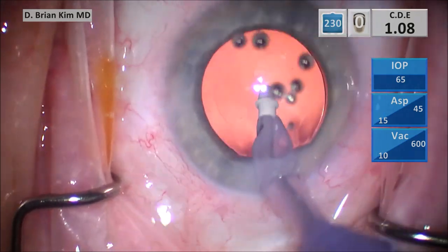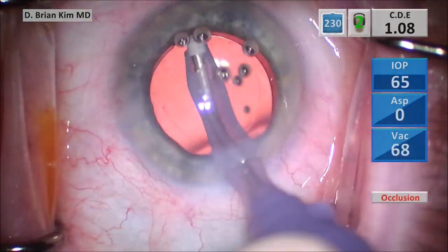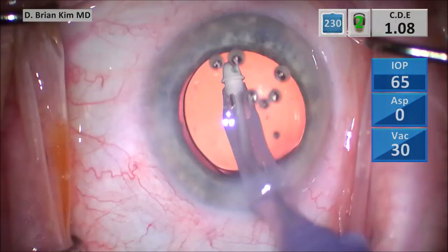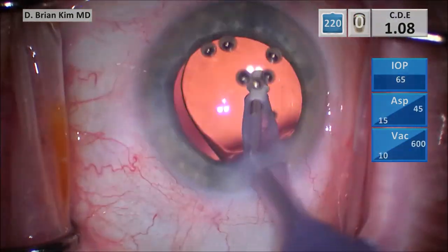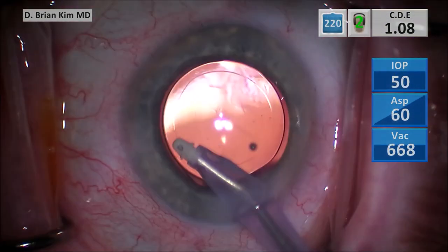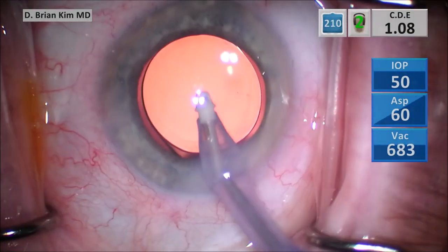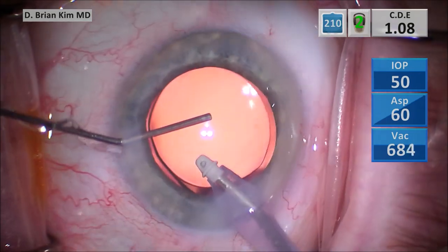Once I clean the bag of all the viscoelastic, I begin to polish underneath the anterior capsulorhexis rim again. There is still a small amount of lens material remaining after I did the capsule sweep. I'm going around underneath the lens again — I see some fine lens material adherent to the posterior capsule surface, which is why I went under the lens to do a little bit more polishing. Once I'm done, I'm removing all the viscoelastic in the anterior chamber.